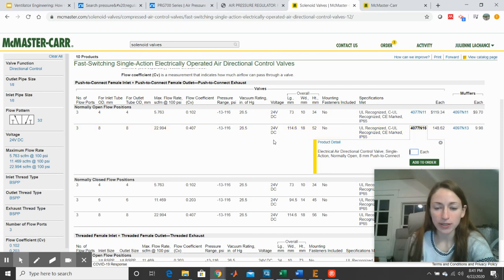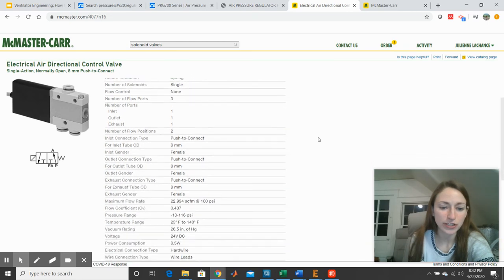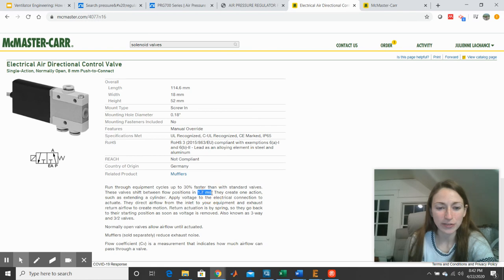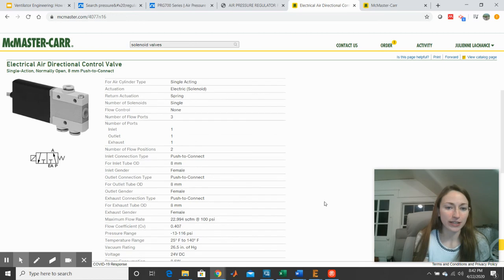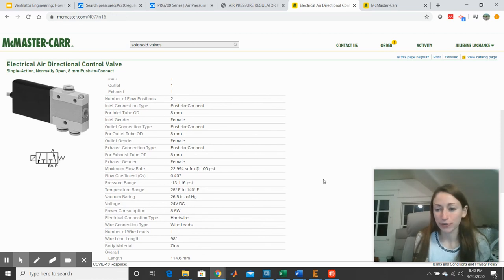Vacuum rating. So I found that the 12-volt DC solenoids tend to have a larger flow coefficient than those that take smaller voltage levels. And then I'm going to look at the product detail to see if there's anything I'm missing here, such as this speed. Let's see how quickly this actuates. I think I have to go all the way down to the bottom to check that it shifts between flow positions in 1.7 milliseconds. So if you're doing some type of PWM-based control, you need to understand if this is going to be fast enough to handle your control scheme. Okay, so I may consider this as a potentially viable solenoid option, but I'm probably going to spend a little bit more time online to see if I can look for anything that has a bigger flow coefficient.